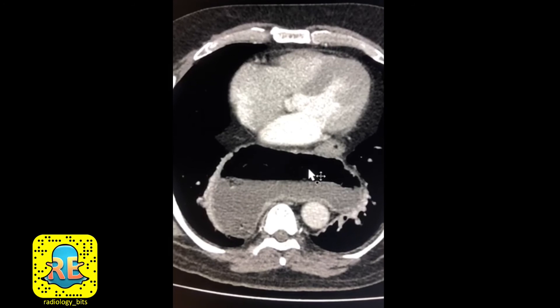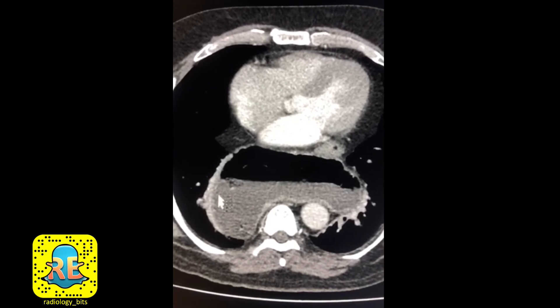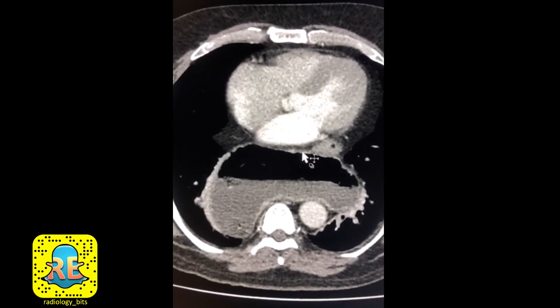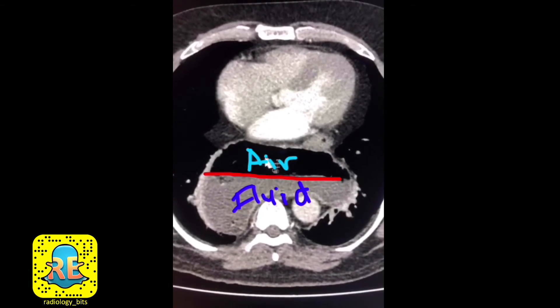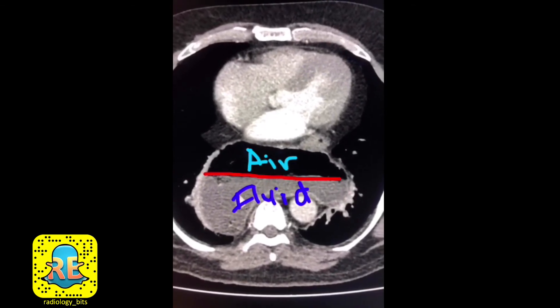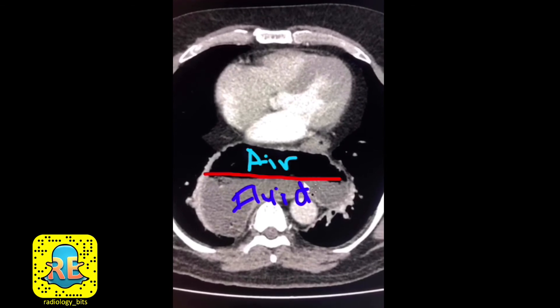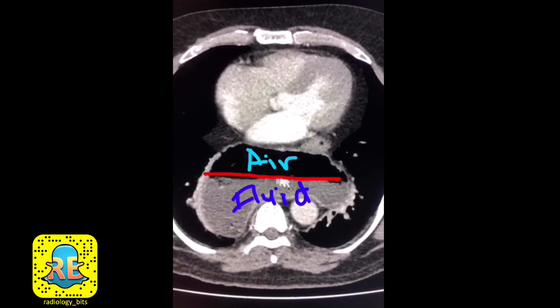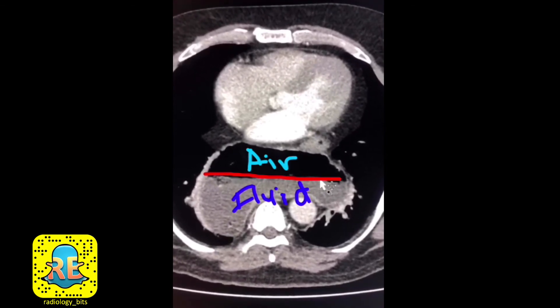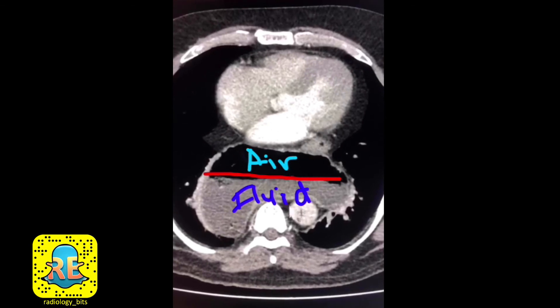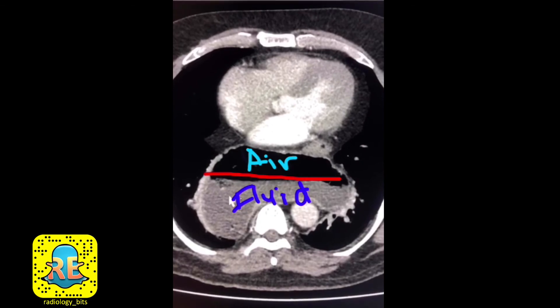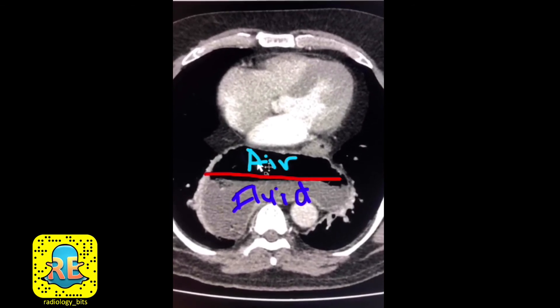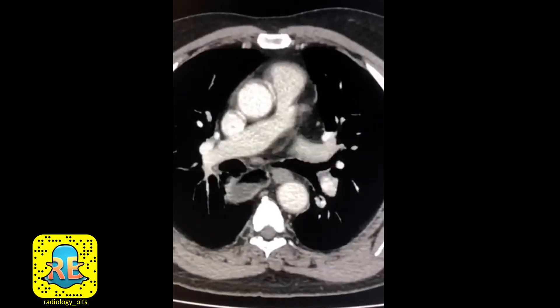The abnormality corresponds to what you saw on the chest radiograph. On CT, you can see air density, fluid density, and a fluid level — similar to what you saw on the chest radiograph. Remember that on a CT scanner the patient is lying on a table, so the back is to the table, which is why fluid is below and air is above.